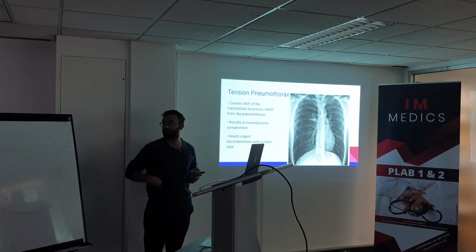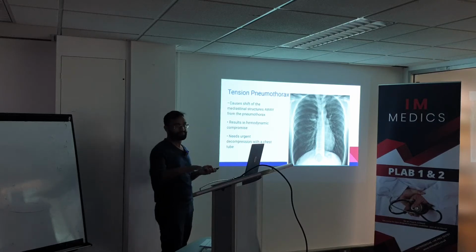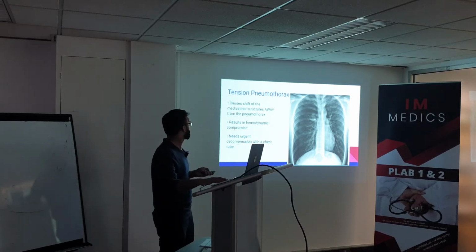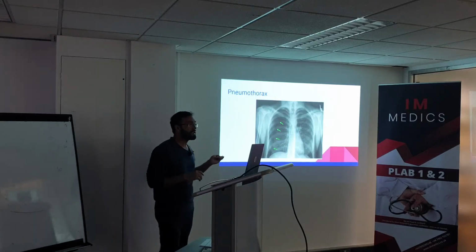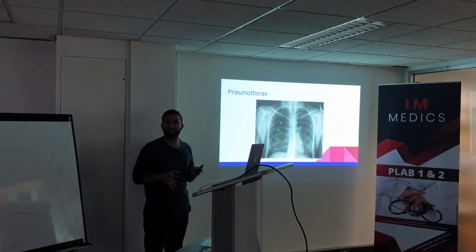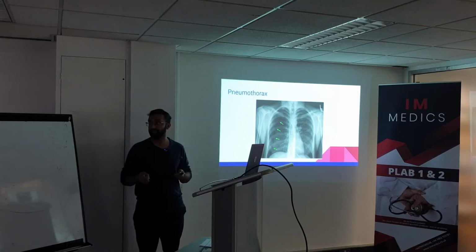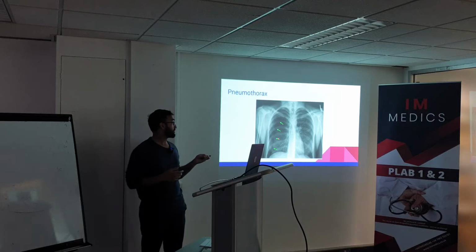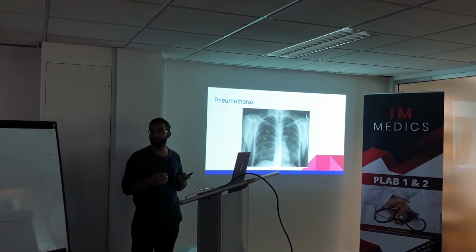So do you know where you would normally put it? And what else? Anything else? So even when it comes to medicine itself, if you have a pneumothorax and you don't really see it in the X-ray, there's another way: you can do a repeat X-ray to see it. So you ask them to have a repeat X-ray when they expirate. So when they're breathing out, the pneumothorax itself wouldn't change in size. So then you will know that this is a pneumothorax.